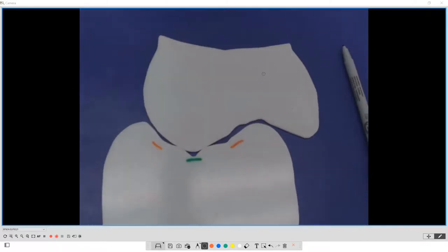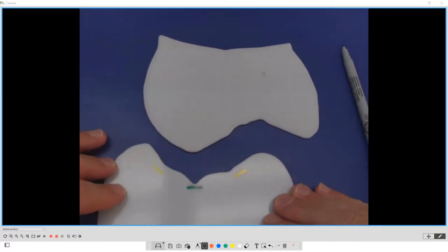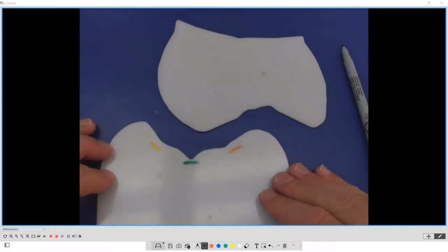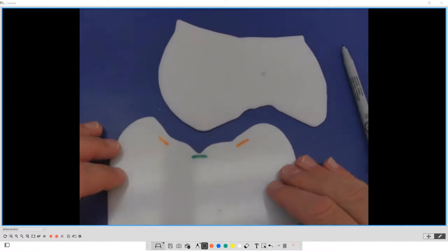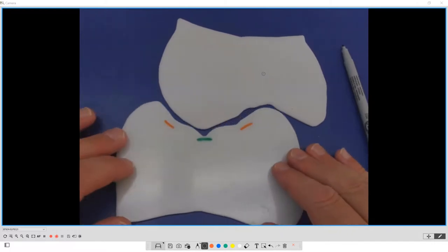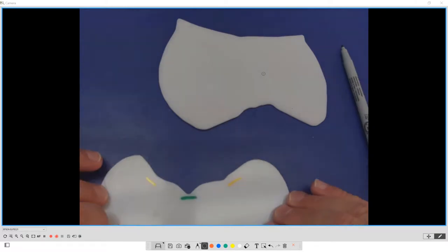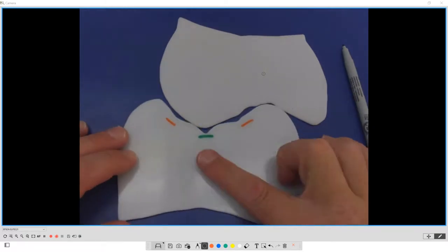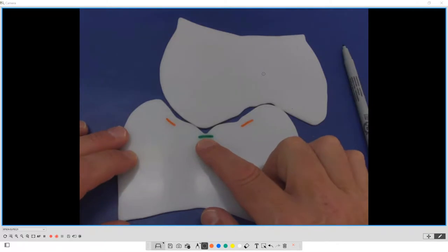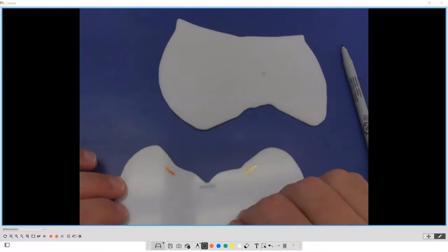This is about denture integration into the body. And this is about also thinking about a senior citizen. So everyone has a chew cycle. It's either more vertical or it can be more horizontal. And the trick is it doesn't hit the red guiding planes and it lands into the helicopter pad without touching along the way, regardless of your chew cycle. That's what I want.